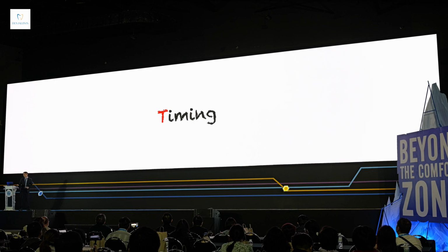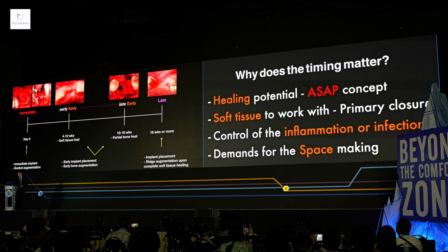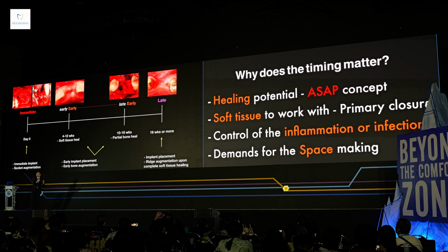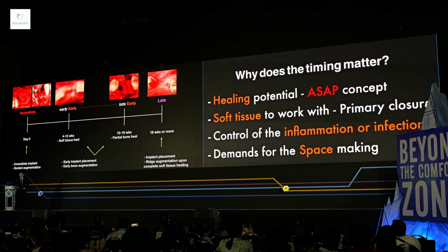So timing. When I talk about timing, it's based on a publication by Dr. Buser regarding the timing issue. After extraction, it can be categorized into immediate, early, and late. I modify it a little bit. Immediate means I do it at the time of extraction: immediate implant placement, socket augmentation, socket preservation, all done at the time of extraction.